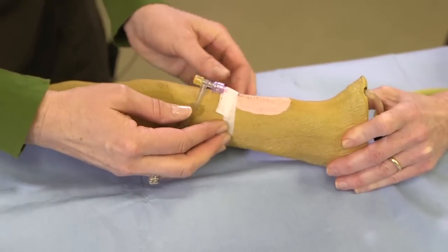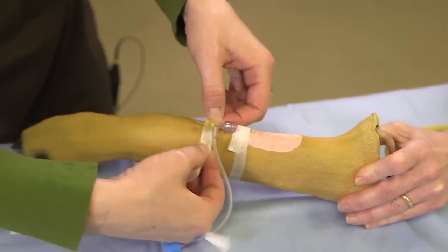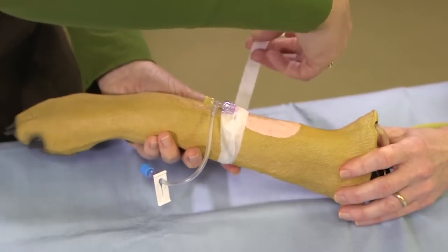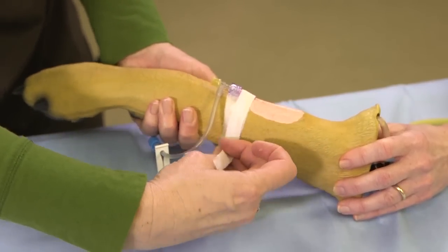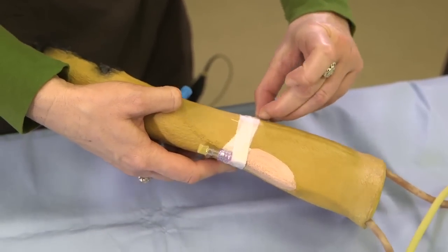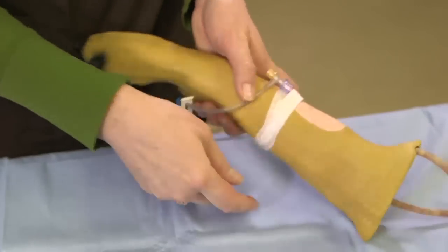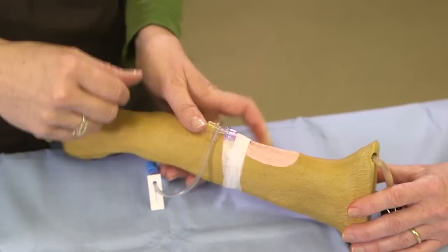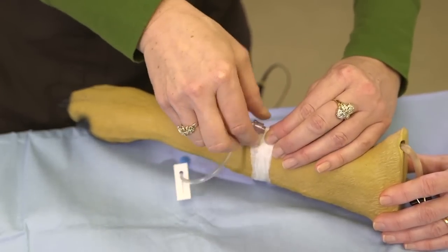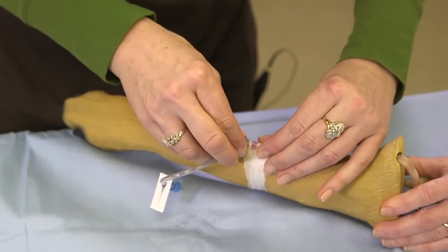Make sure this is really nice and secure but not too tight. Another piece of tape sticky side down — you go under your catheter, take this piece of tape, stick it on to that other side and around. It's much easier when you have a nice still patient. One thing to keep in mind is what's going to happen when it comes time to take all of this off. It's a good idea to take these pieces of tape and make little tabs — that way it's easier to grab. Always be mindful that you want access to the end of your catheter; you don't want tape covering it, so make sure that is exposed at all times.